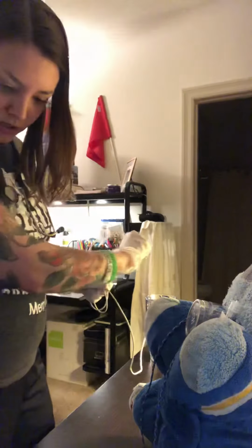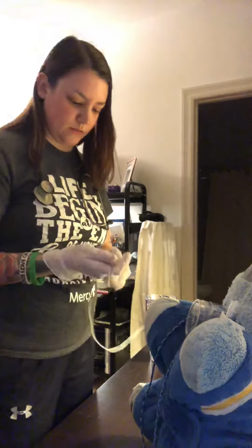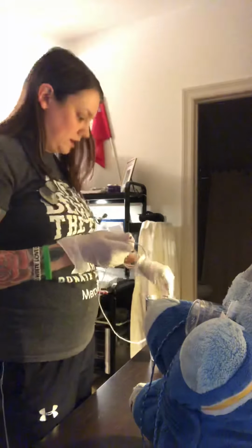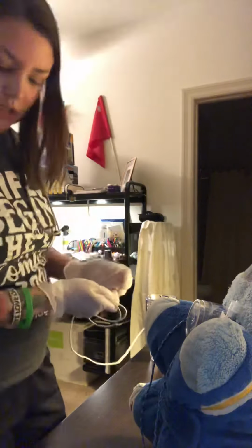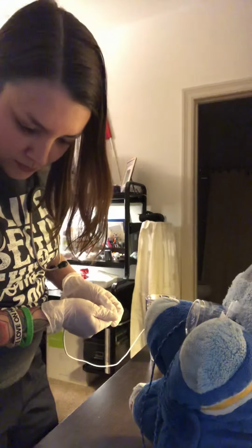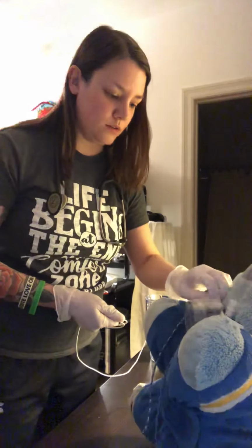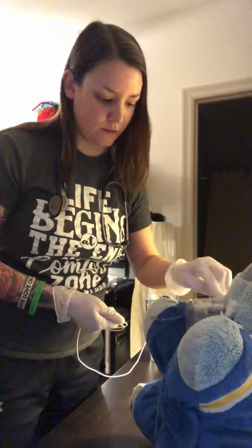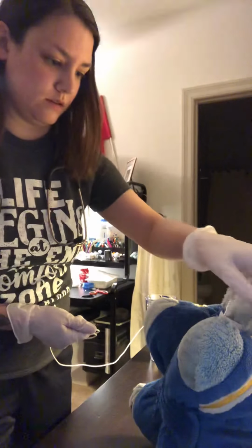Then I will go ahead and turn on, I need to put it in my right hand, sorry, that's my dominant. Okay, so I put all that in there, and I'll turn the suction machine on. I would put it in sterile saline to make sure it's suctioning correctly. Then I'm going to go ahead and remove the mask here. I should have already had that kind of pulled out. Okay, just kind of set it over here.